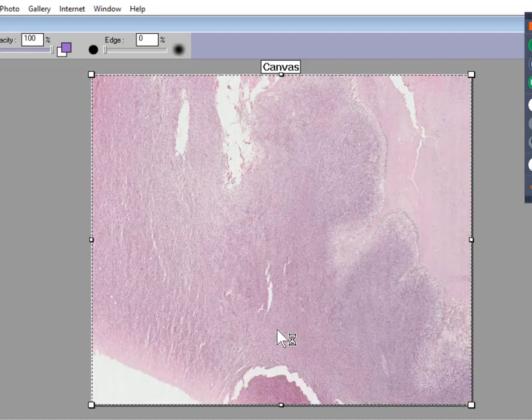It's very highly pleomorphic and malignant. Not only does it have large areas of necrosis, but it has perivascular necrosis as well, away from the blood vessel. And what you'll see here is lined up as palisading. This is the classic 4 or 5 descriptions of the most common type of highly malignant brain tumor, which is called the glioblastoma multiforme. Now you think, well, why would you use such a crazy long term, glioblastoma multiforme?